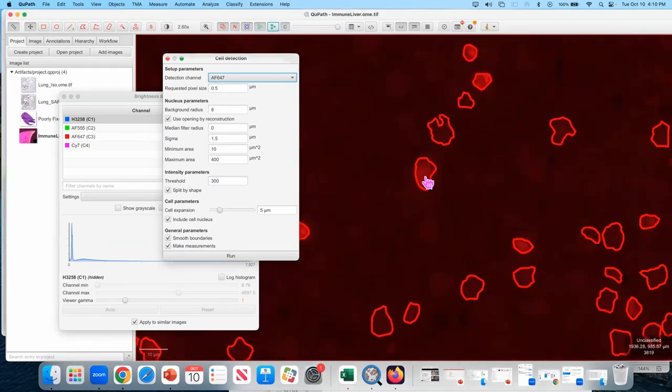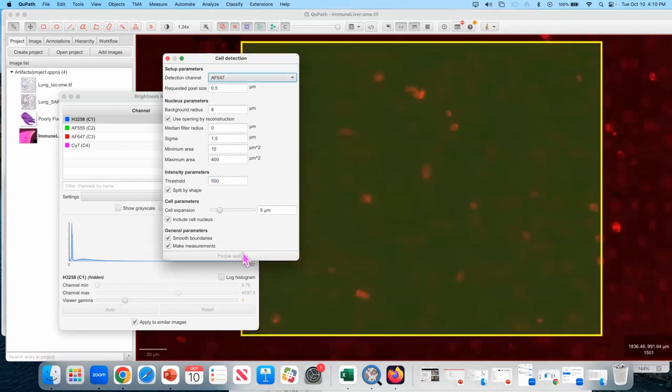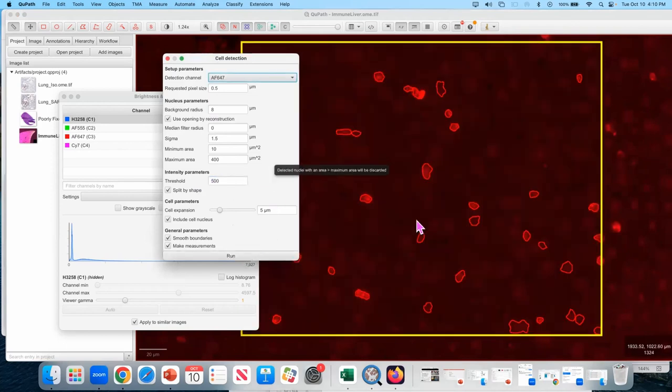And now because I don't have nuclei, cell expansion is not as informative, right? Because that's really the membrane or close to the membrane. So I switched to seeing only the nuclei, and I definitely need to increase my threshold because I'm picking up a lot of noise. And there's still some work to do here, but you can see that this tool can actually be used to detect at least something that looks like it's a positive cell in this image.